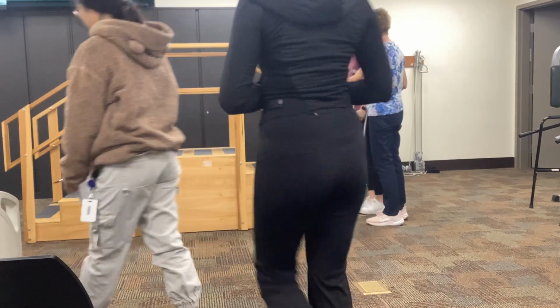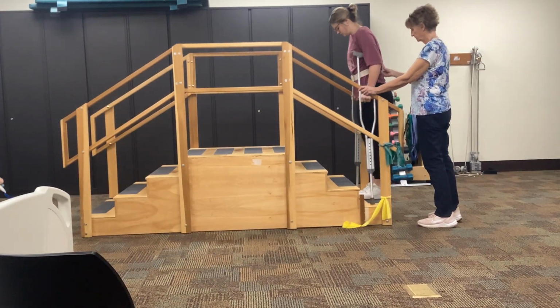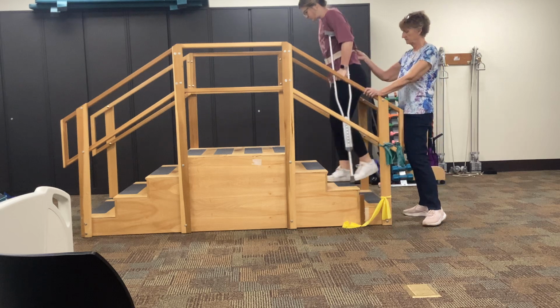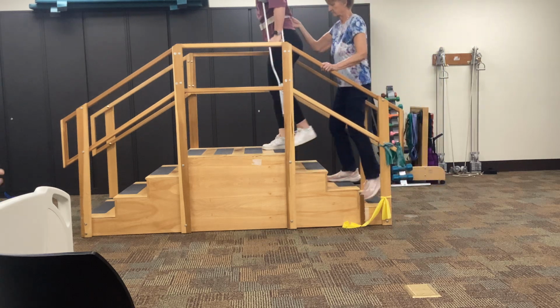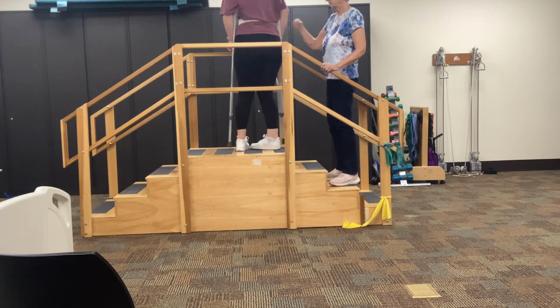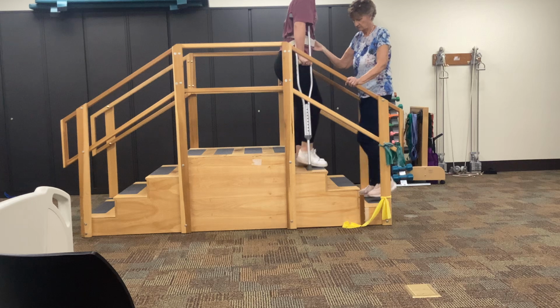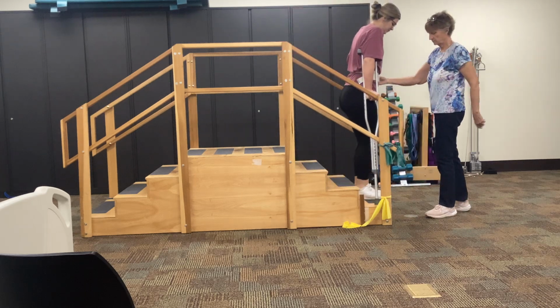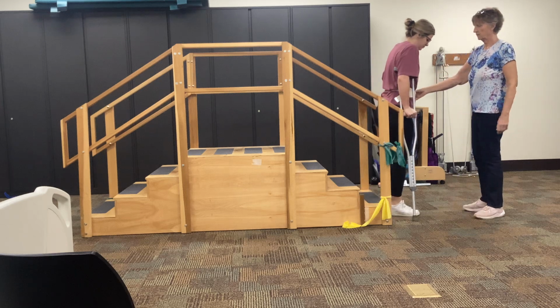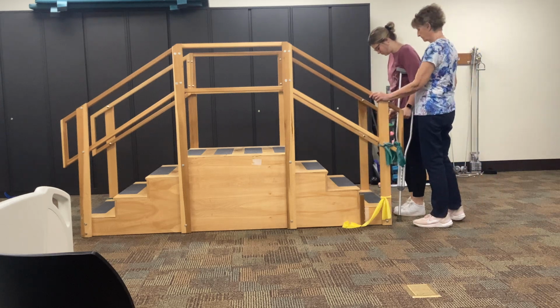I'm going to go up the stairs. Okay, come on down. All right, turn around. Progression for 2-point gait.